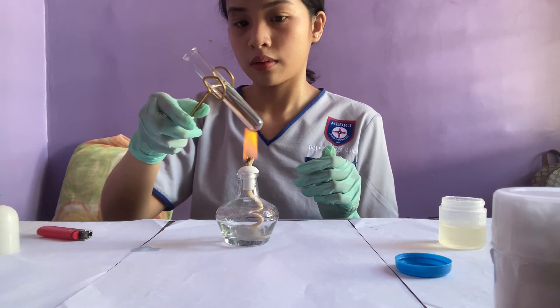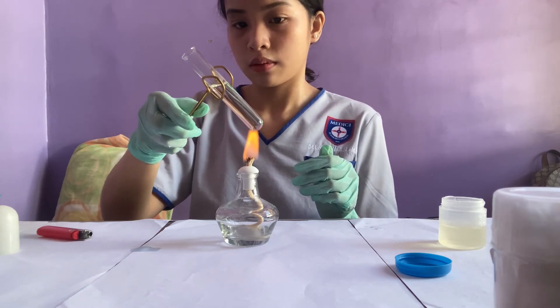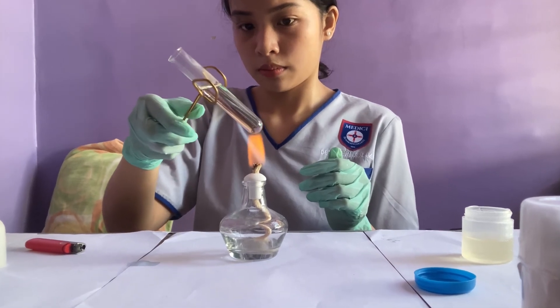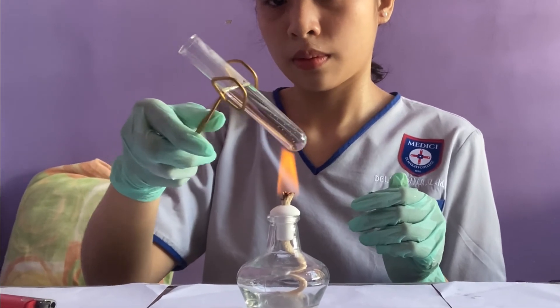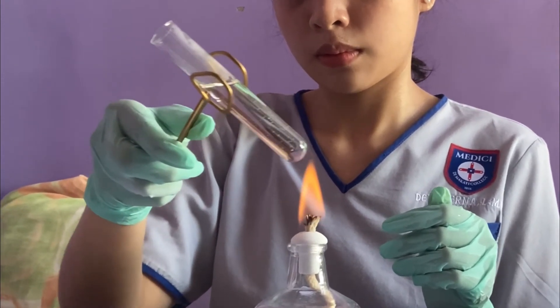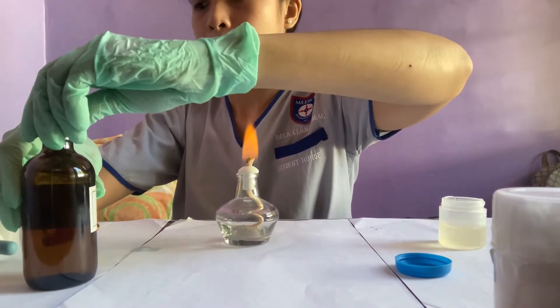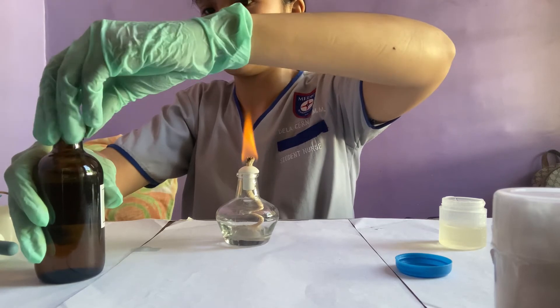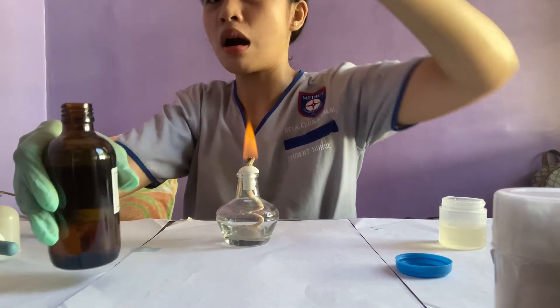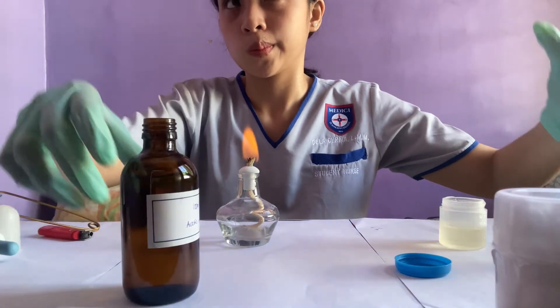We're going to bring this to a boil and then add a few drops of acetic acid. As you can see, my test tube is near boiling point — the bubbles are rising. After boiling, I set it aside, took the acetic acid, and dropped a few into the test tube, then boiled it again.